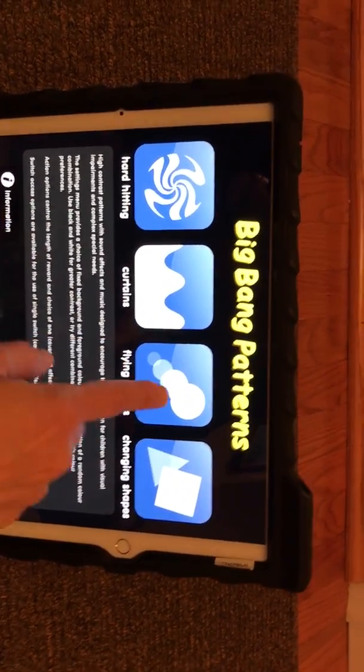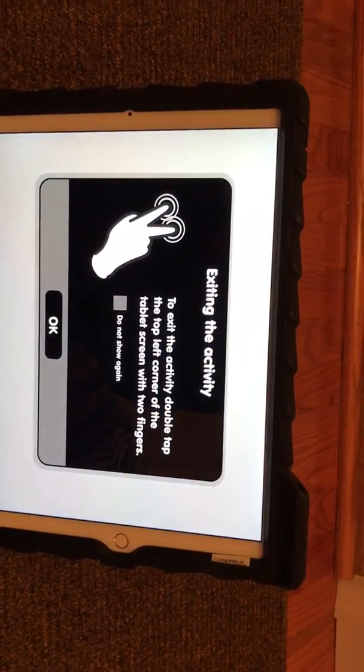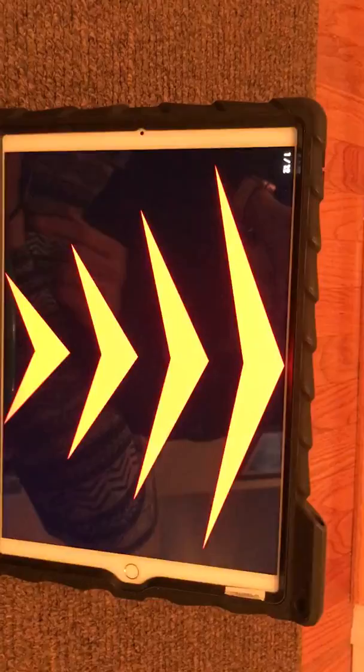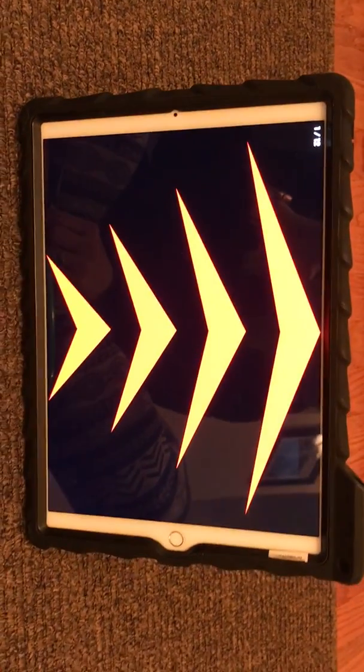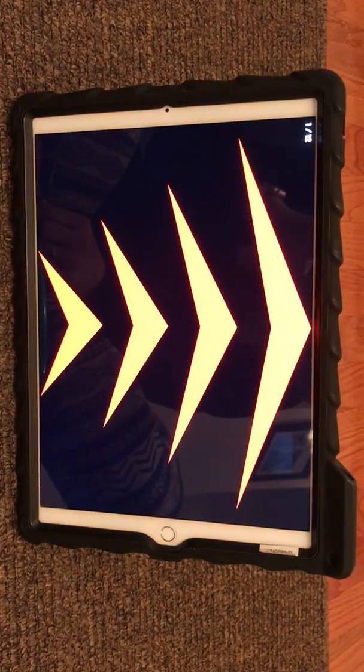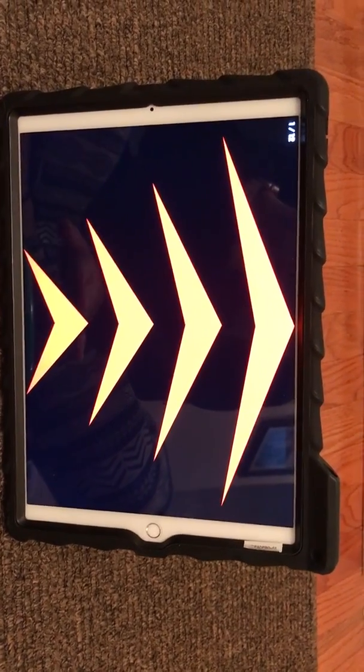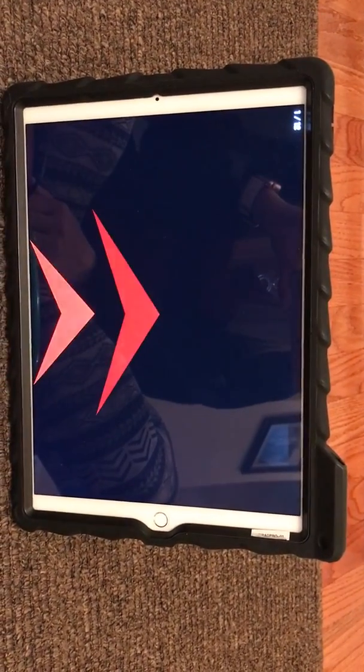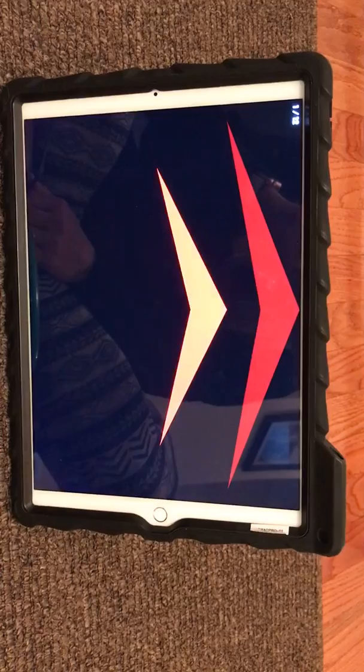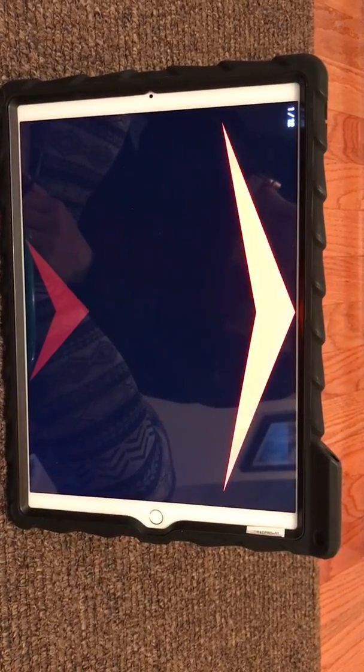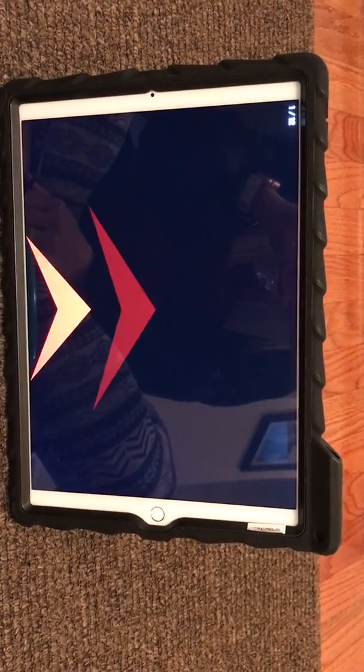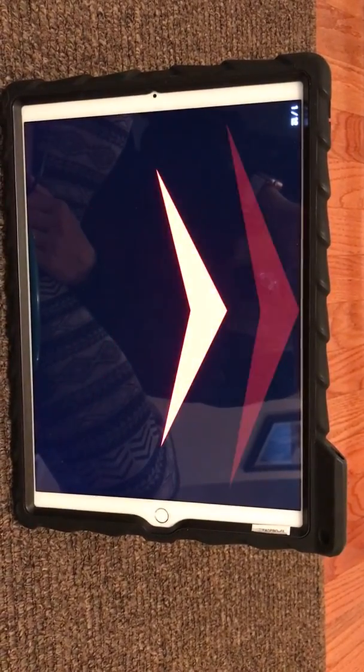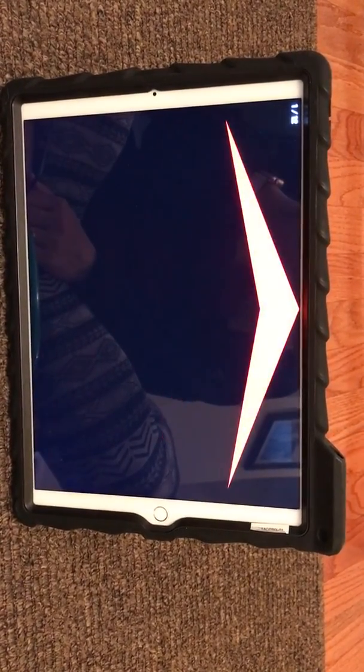It gives you the auditory prompt, the person hits the switch, music plays, and then it stops. It gives you a quick auditory prompt.